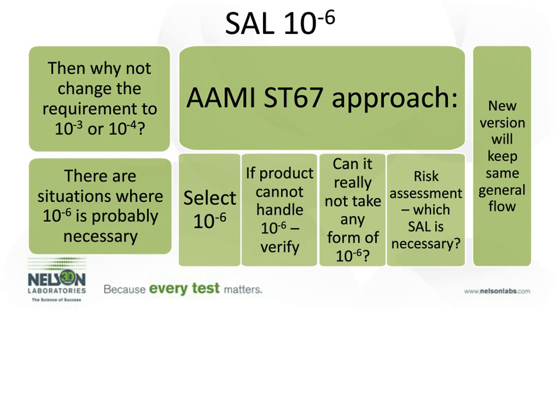Now, it should be noted that there are cases where 10 to the minus 6 probably is necessary. So we will likely not ever see a situation where the overall expectation is changed to 10 to the minus 3 or 10 to the minus 4, for example. So we should not expect to change the target SAL from 10 to the minus 6 to something else.